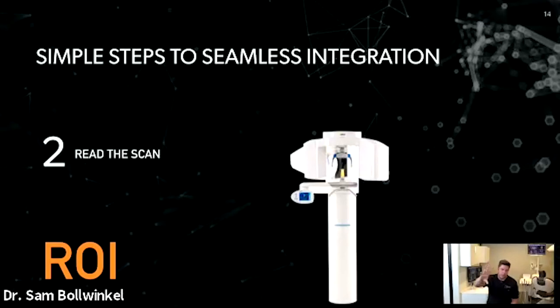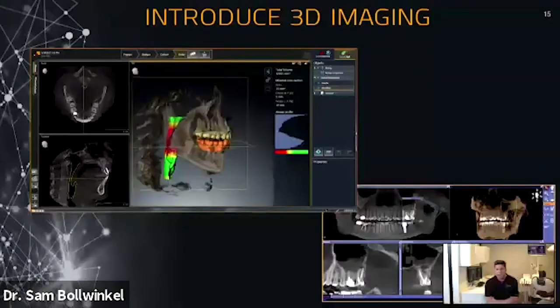And again, use a resource like Dr. Timothy to tell you what you're seeing. Take the image, read it, have somebody tell you what you're seeing, review it again. Great opportunity to expand your knowledge and your ability to treat your patients. So, read the scan.